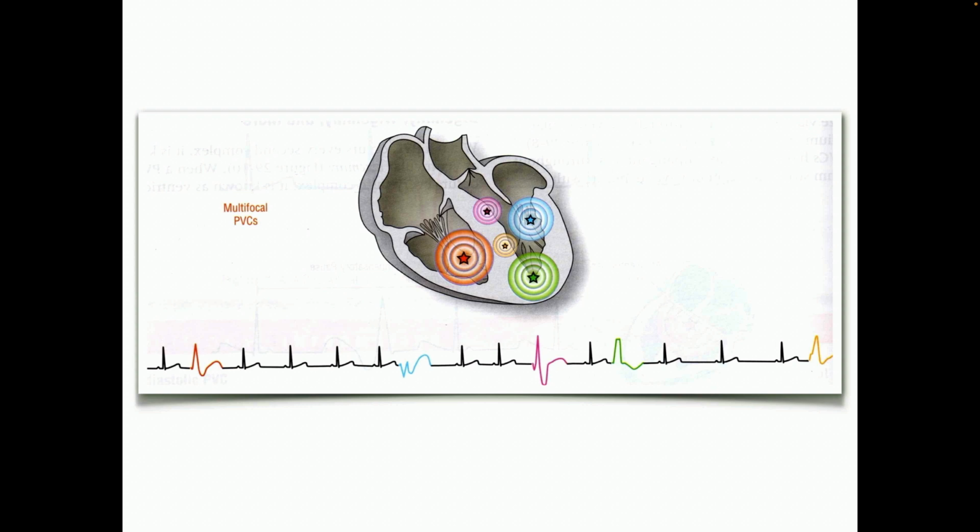So again, if I said, what is this? The answer is still normal sinus with PVCs, but I do want you to recognize that there's a difference between unifocal and multifocal. Which one do you think is clinically more serious? And why? That's correct. Why? Because there's lots of different firings. Yeah, so lots of different irritable foci. Something has to cause multiple irritable foci.